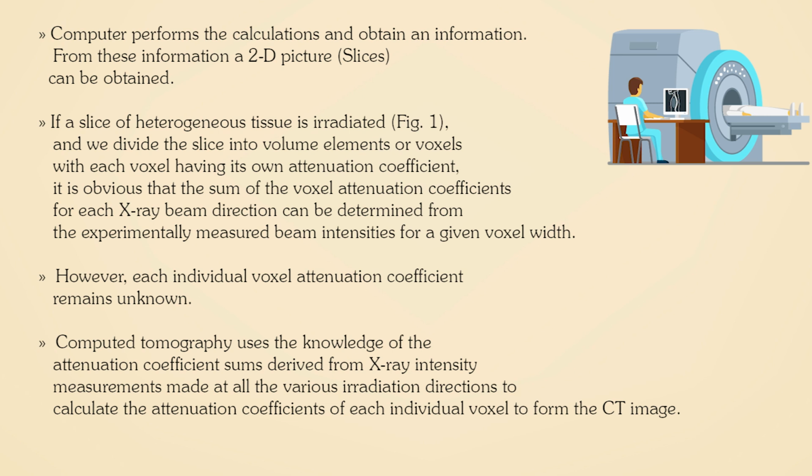Computer performs the calculations and obtains information. From this information, a 2D picture, that is slices, can be obtained.